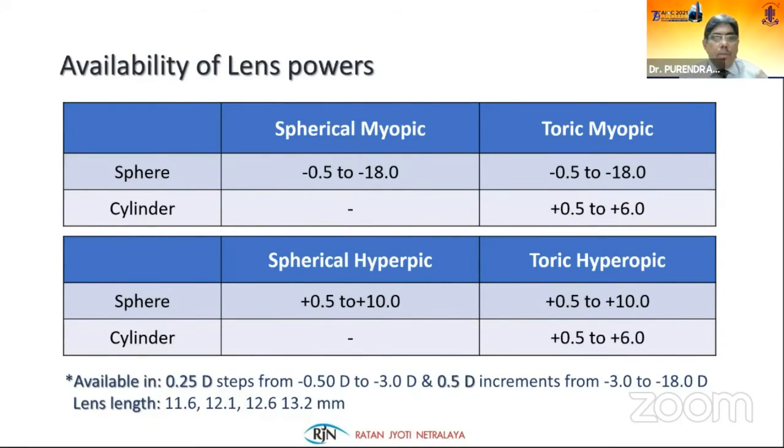We have done it in uniocular eyes also. When there is uniocular myopia, the patient doesn't find any problem between the natural eye, the natural crystalline lens, and the unoperated eye, when we have done it in one eye as well.